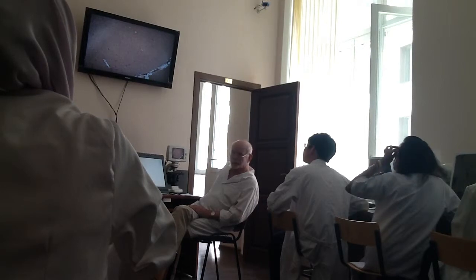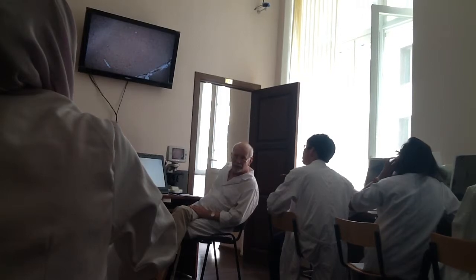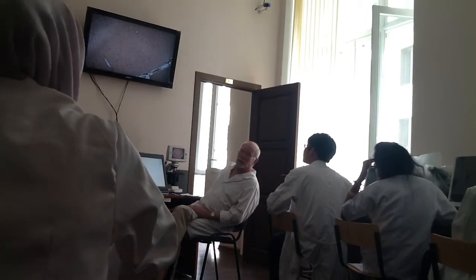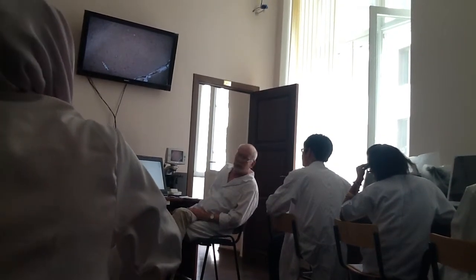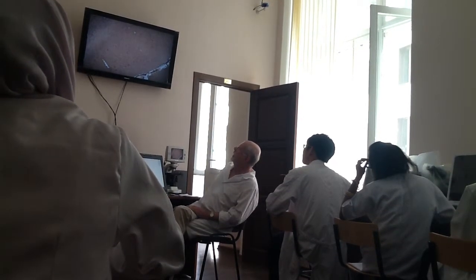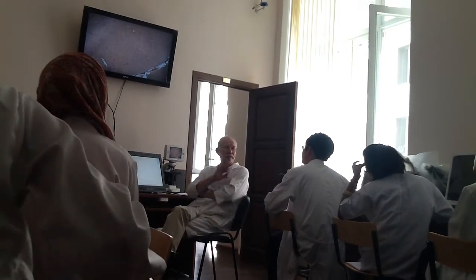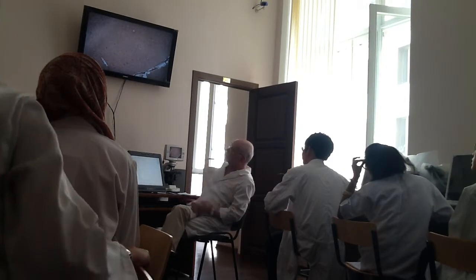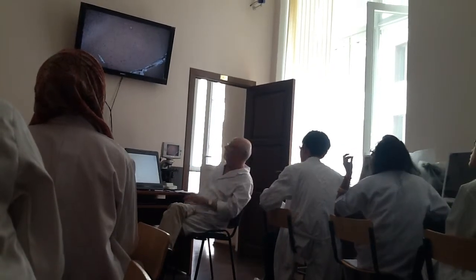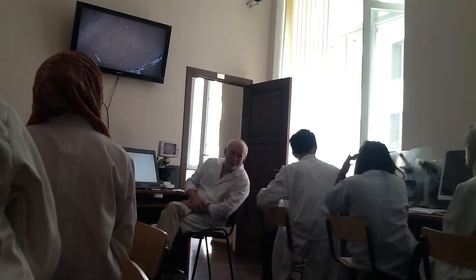You found the first, the third, the fifth, and the sixth. So, second and fourth. To show external granular, put the pointer here between molecular and pyramidal, in this region. Put the pointer and see. It's outer granular. If you want to show inner granular, put the pointer between the largest neurons and pyramidal neurons here and say it's the inner granular layer.